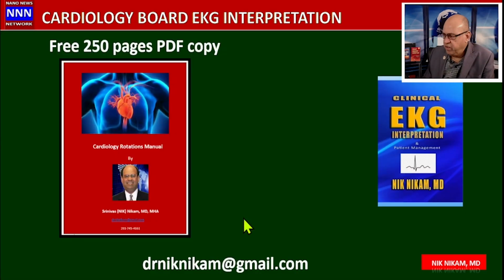So, ladies and gentlemen, this is a very quick overview of acute myocardial infarction, the coronary anatomy, the location of the myocardial infarction, the leads that represent the given anatomy of occlusion, along with the EKG changes that are related to hyperacute phase or an old myocardial infarction. Always remember, in order to diagnose a myocardial infarction, we have to see changes in at least 2 or more leads.